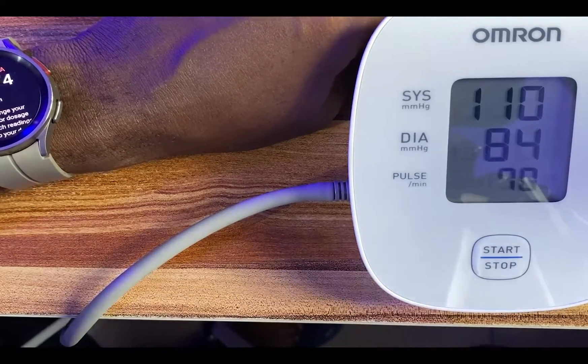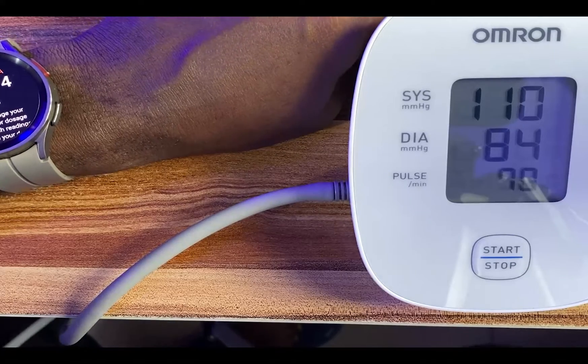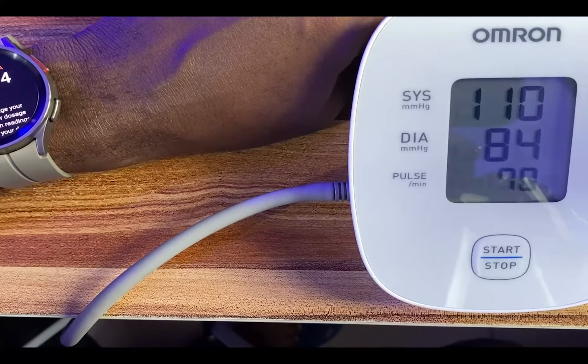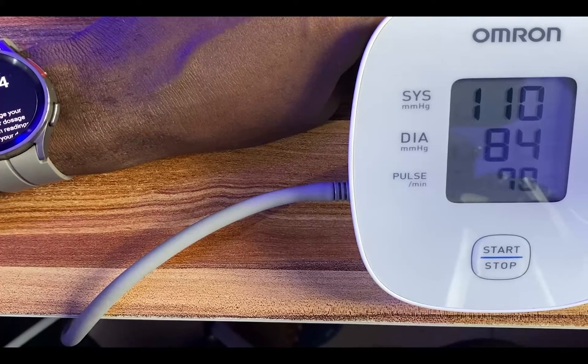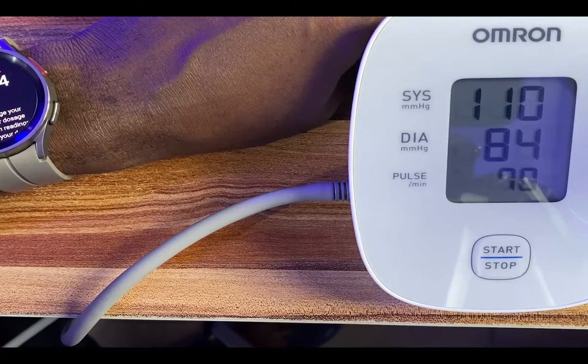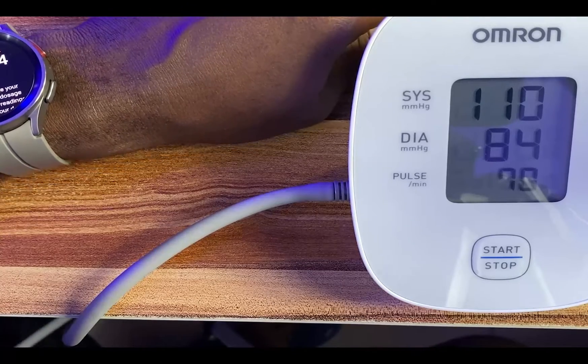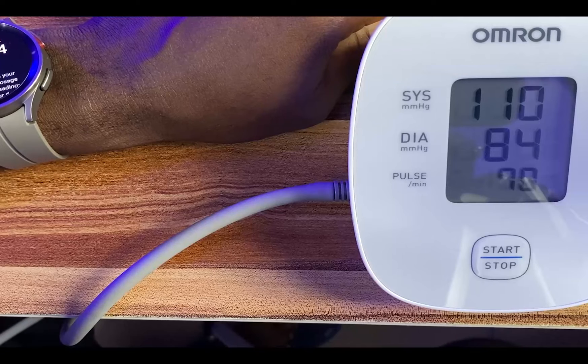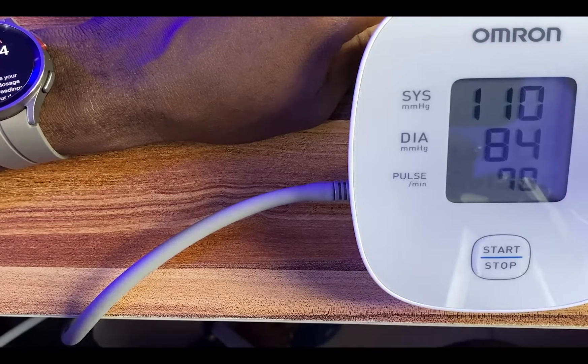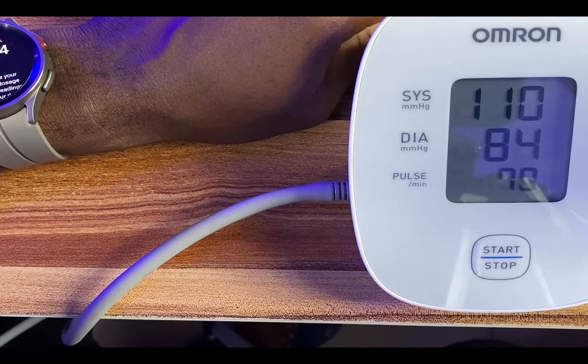Here we go again. This is the second measurement. For the Galaxy Watch 5 Pro, it is 112 systolic and 74 for the diastolic, and the pulse rate is 73 beats per minute. For the Omron blood pressure monitor, it is 112 over 84, and the pulse rate is 70 beats per minute.